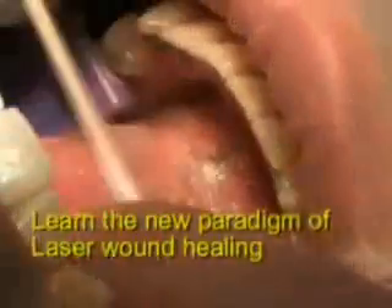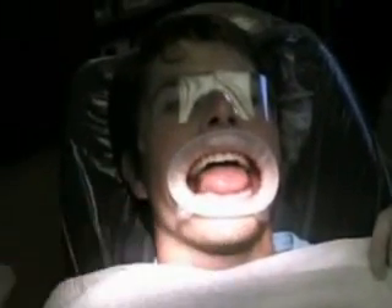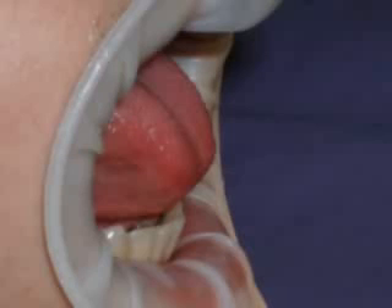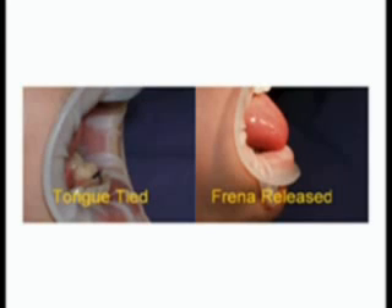A laser produces a new paradigm in the appearance and healing of wounds. It takes about three to four weeks for conventional wound healing, but only three to seven days for a laser wound. A conventional surgical wound has pain and swelling, whereas this has no pain, no swelling, no bleeding.